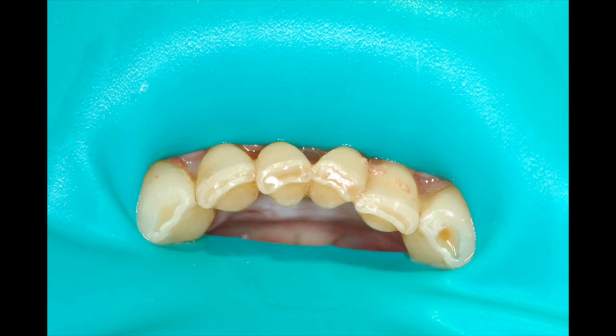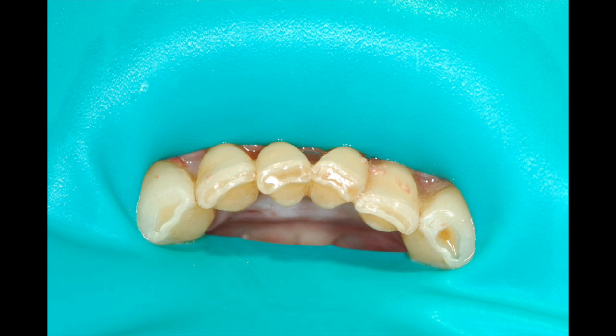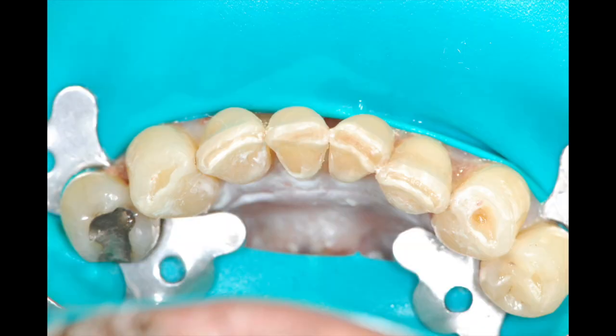When a patient presents with rotation or malocclusion, sometimes I may have to do a minor enamelplasty to align the teeth and keep the material as thin as possible.